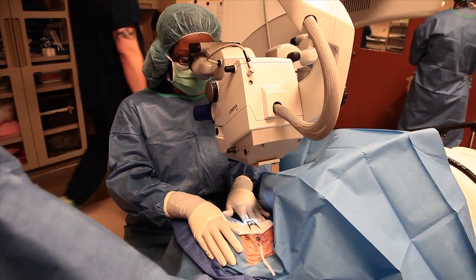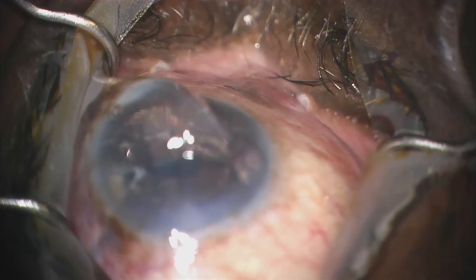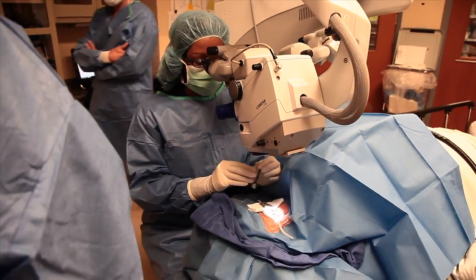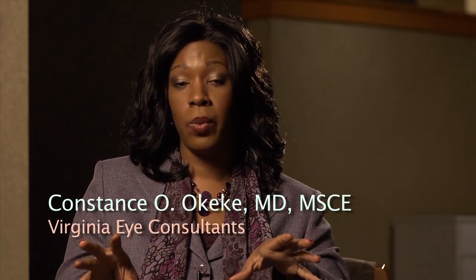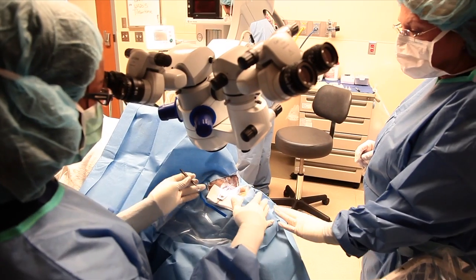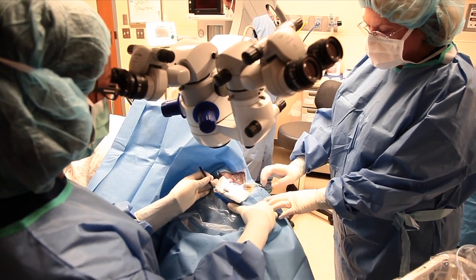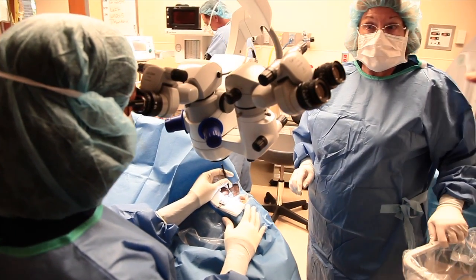As I turn the patient's head away from me, I will put some viscoelastic on the surface of the eye, on the cornea, and then I'll take my gonio lens to see that I have a good view. If I do not have a good adequate view where it allows me to see the trabecular meshwork very well, then I will turn the patient's head even more in order to get a good view. All right, I'm going to be turning your head over to the side a bit more. It is essential to have a very good view of the angle before you even begin the surgery.